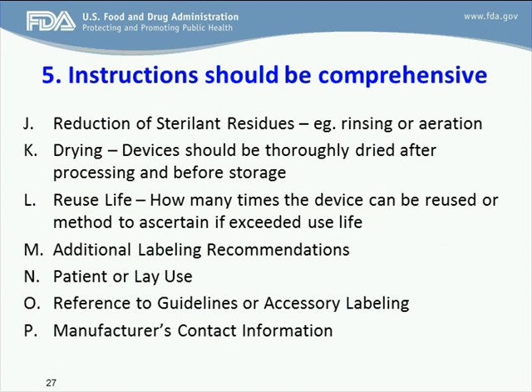The labeling should either inform the user how many times the device can be reused based on testing, or provide the user with a mechanism or method to ascertain whether the device has exceeded its use life, including a method to establish that the device is still within performance specifications.